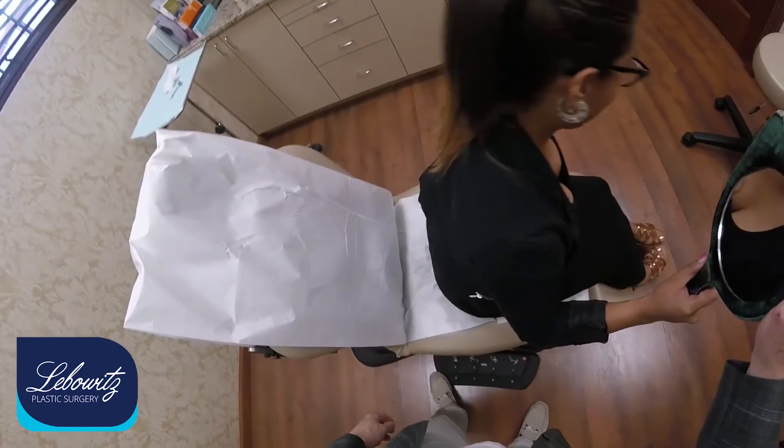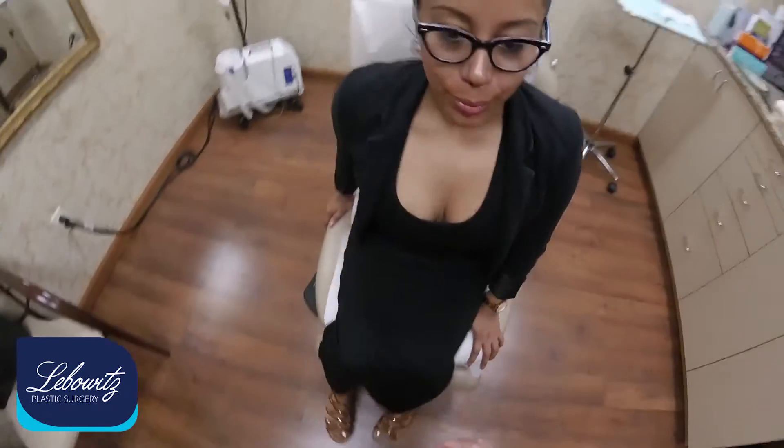And so here are the results — they look great. The patient loves it. As you can see, the results are amazing: perfect, symmetrical, no bruising. She can go out for lunch and she can go to work. This Juvederm product lasts about a year's time, at which point people come back once a year to keep up their look.